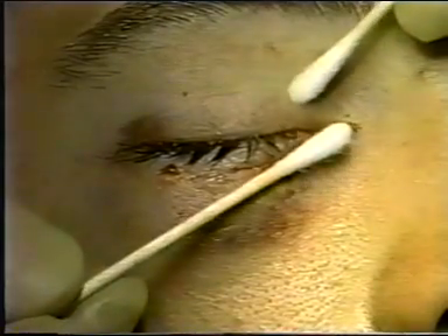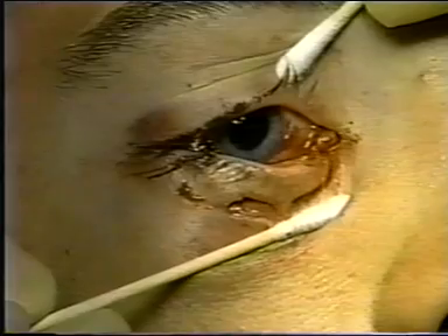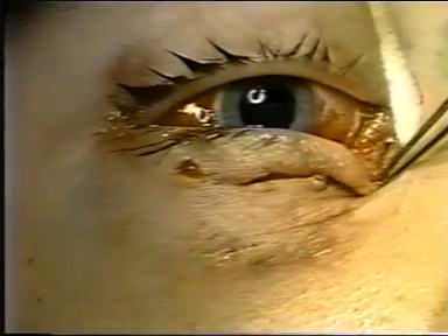After the patient has been cleared from associated ocular trauma, the area of laceration is closely inspected. Using Q-tips, it is possible to inspect the area near the canalicular system. As we can see, the area medial to the punctum has been lacerated in this patient.